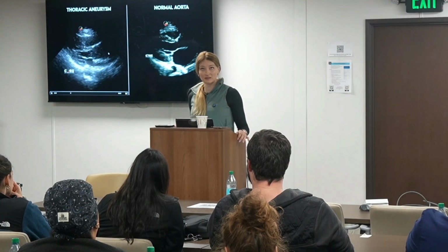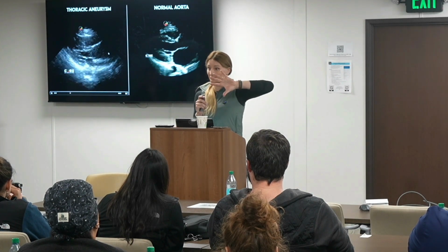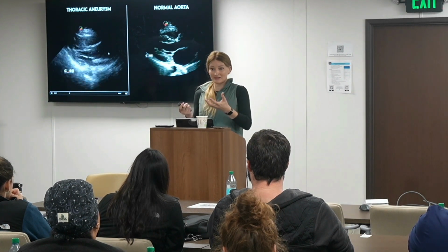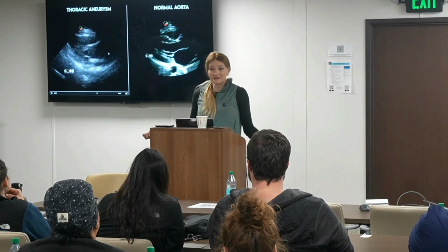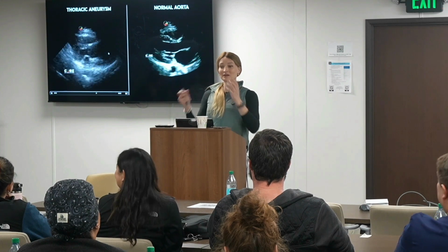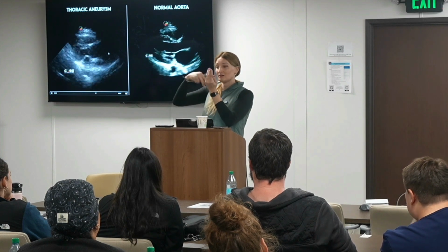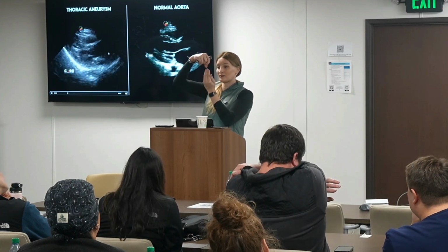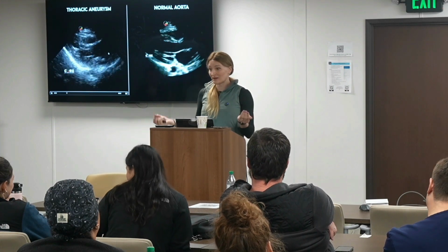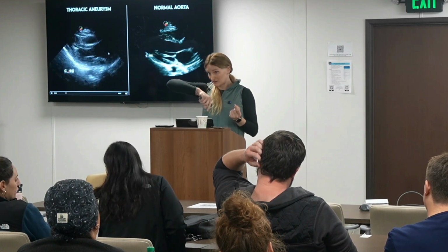One of the things that I talk about is the common bile duct. You know Arthur the aardvark? Not old school Arthur the aardvark, but the more palatable Arthur the aardvark that doesn't have the long nose. Well, before, there was a big proboscis, and I don't think kids like that. That's what it's called. This is a deep reference. It's called a proboscis. But you know what I'm talking about, right? It's the head and then the two little ears. That's what the common bile duct looks like when you look in the portal triad: the portal vein, the hepatic artery, and the common bile duct. If those ears are the same size, I don't actually measure. I know it's normal. If one ear is bigger, as big as the portal vein, then I measure, right?